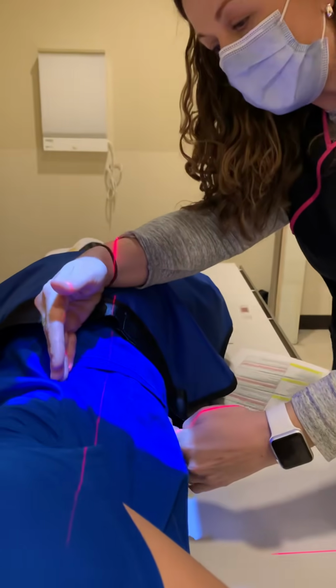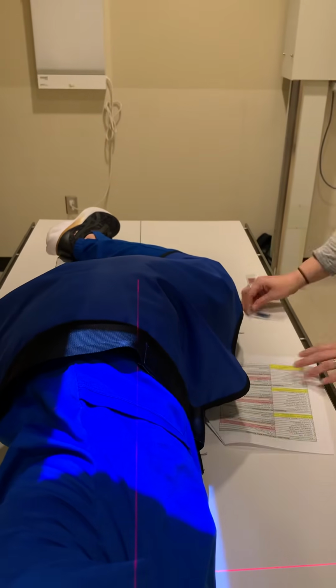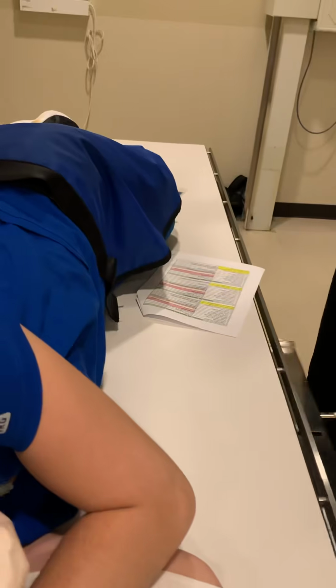And we're going to center once again at L1, L2, the anterior curve of the ribs, or 1 to 2 inches above the lower rib margin. Central ray is perpendicular. Between the mid-coronal plane and the anterior surface is where we center.